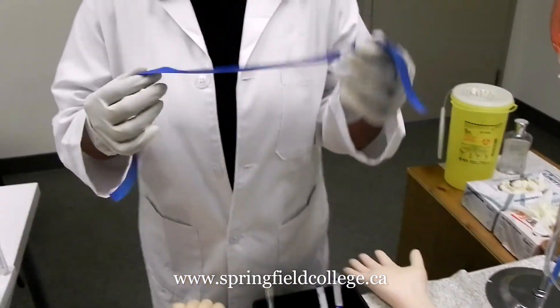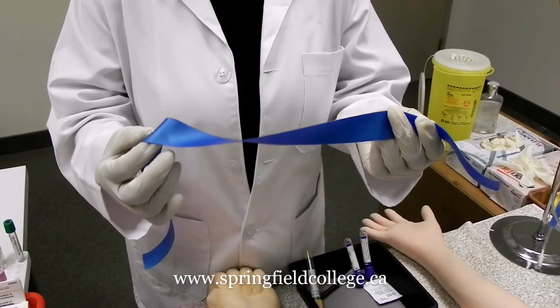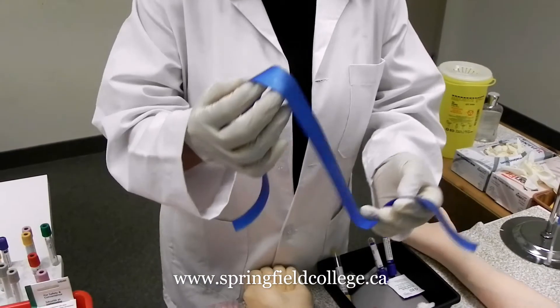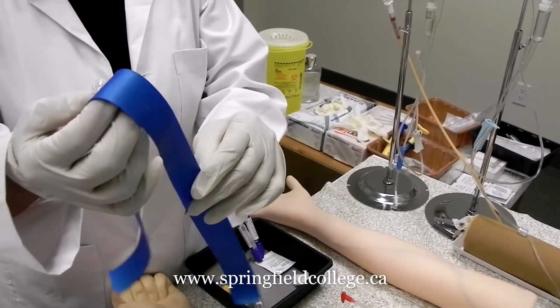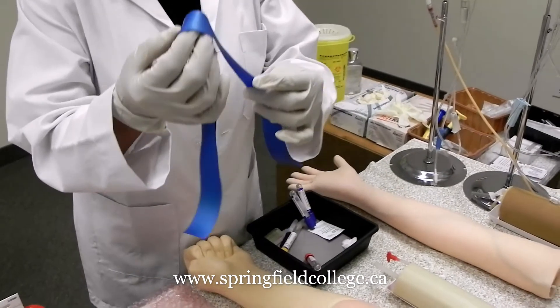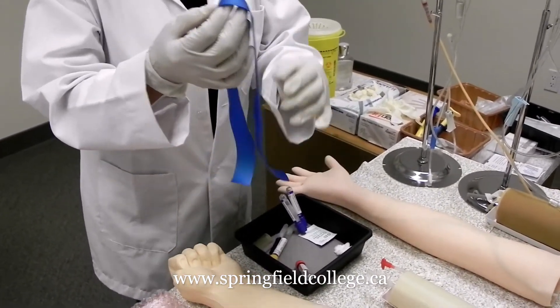First we talk about the tourniquet. A tourniquet could be a reusable one or a disposable one. The most commonly used one in our healthcare practices is the disposable one, and it is always advisable to use the disposable tourniquet for safety and sanitary reasons.